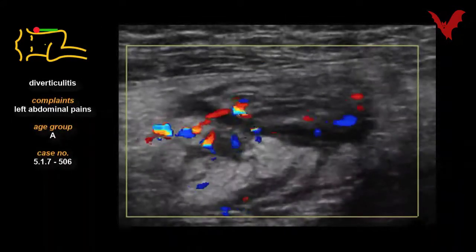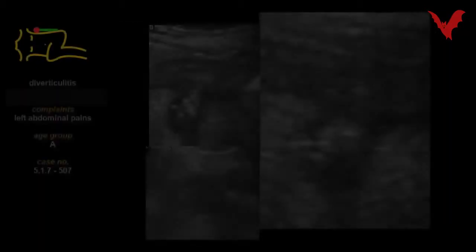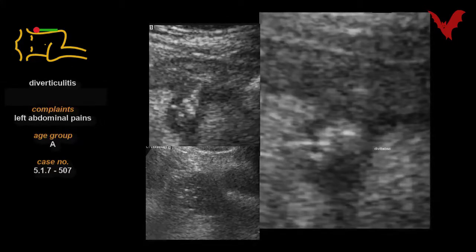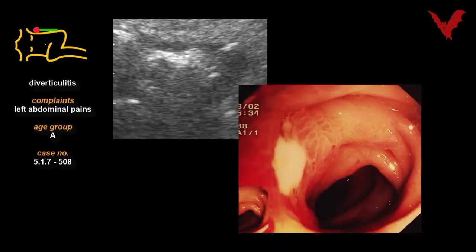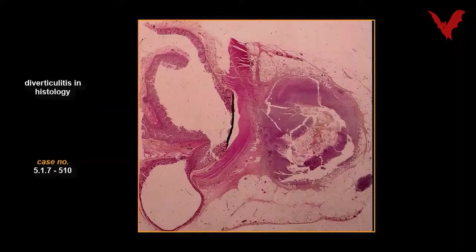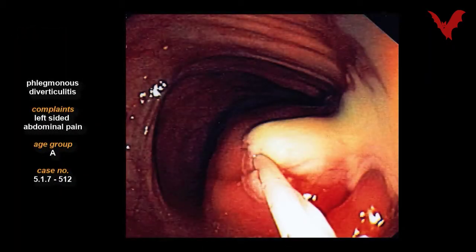The limited use of color-coded echography is shown in case 506. Simple echography is helpful enough alone, as shown in case 507 and again with endoscopy in case 508. Cases 509 and 510 reveal the histological features of diverticula and diverticulitis.